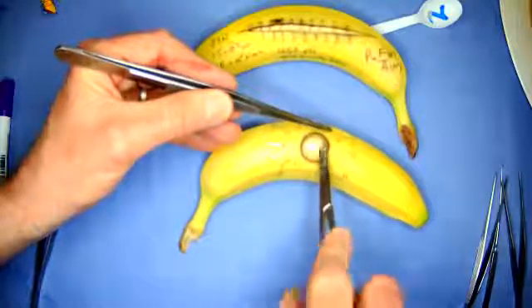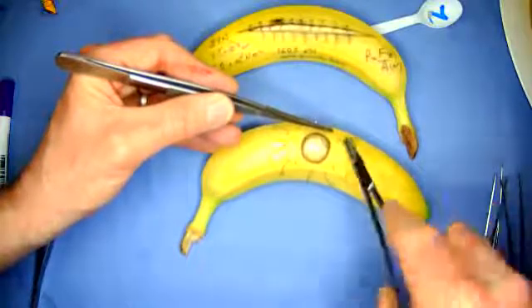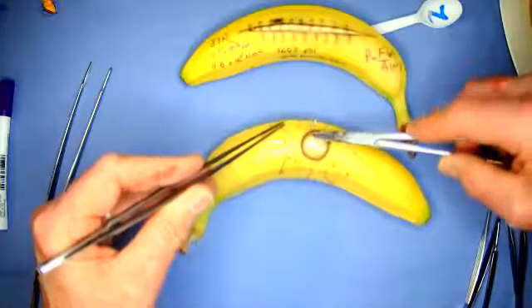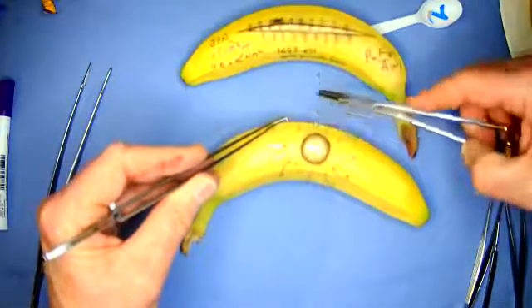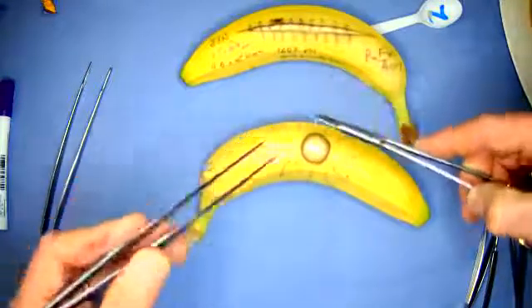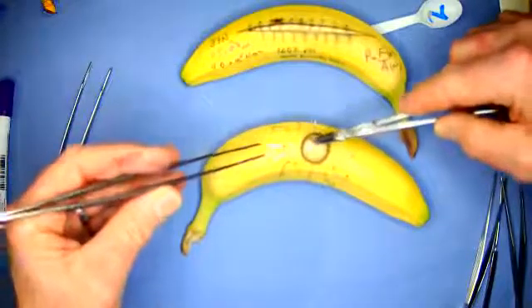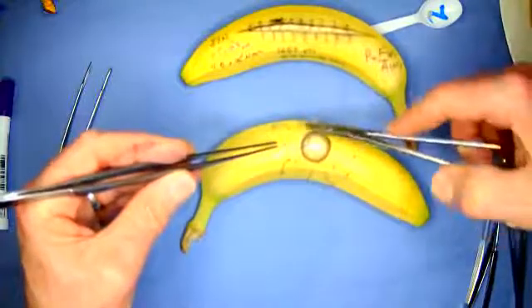Next week, we're going to be talking about the assistant. You can imagine the assistant is going to be predominantly holding a forceps, and they will hold opposite. And pretend I'm retracting tissue and delivering the needle and out. And see there, as I focused, I pulled that out and it slipped out. What you need to practice is going round and round and round without pulling the staple out, and get used to moving your forceps delicately round the model.